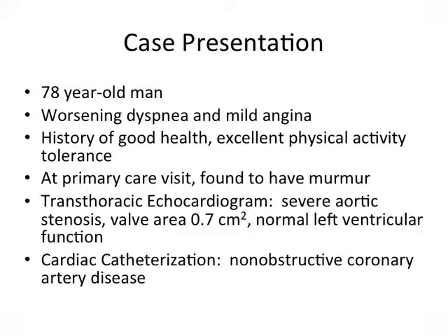This is part one of a two-part podcast reviewing aortic stenosis. In part one, we will review the pathophysiology of aortic stenosis and the basic TEE views used in the operating room to look at the aortic valve. In part two, we will discuss more in depth the quantitative evaluation of aortic stenosis with TEE.